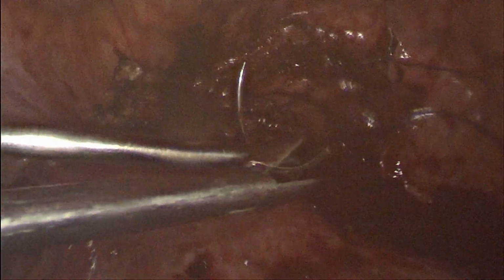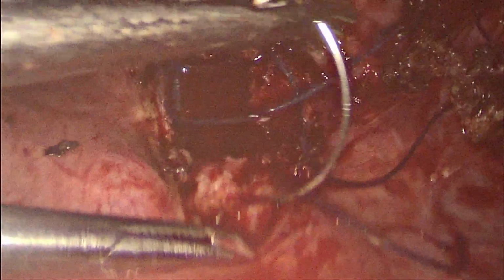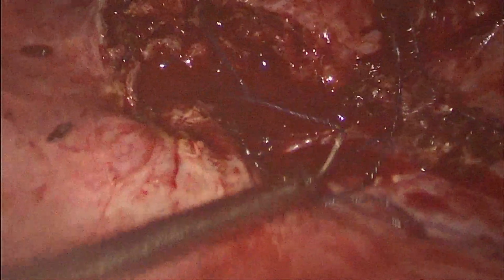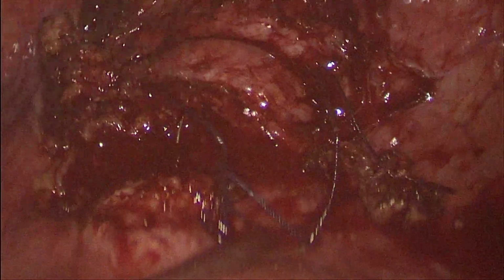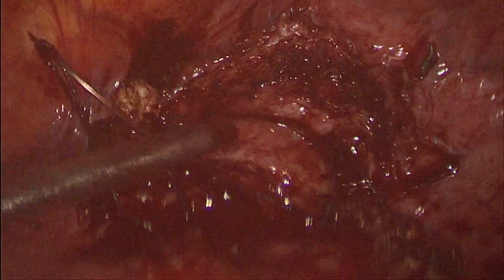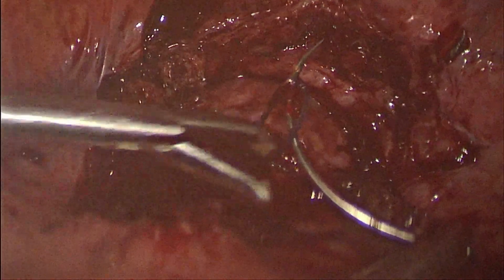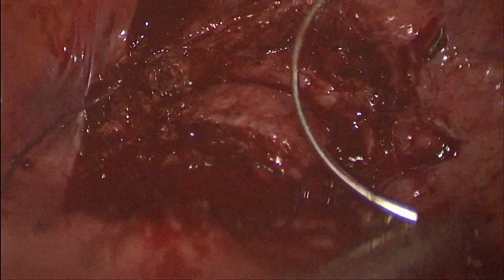We are taking a simple stitch. It can be done with barbed sutures as well, which will be a faster way of completing the approximation. But most importantly, we should approximate muscle fibers to muscle fibers without obliterating the uterine cavity. Only the anterior wall should be sutured; do not include the posterior wall while suturing.